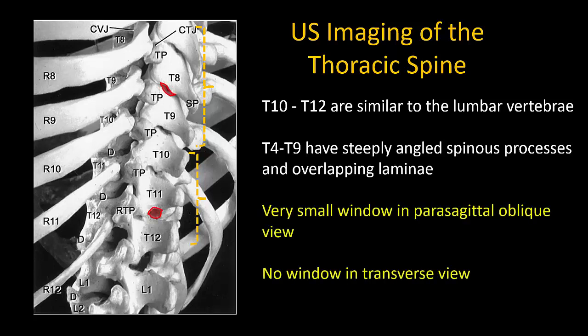This leads to very small imaging windows in the parasagittal oblique view and no acoustic window into the vertebral canal at all in the transverse view.